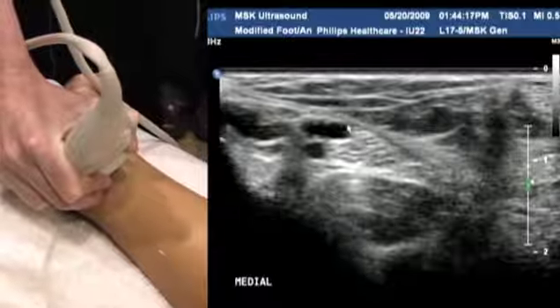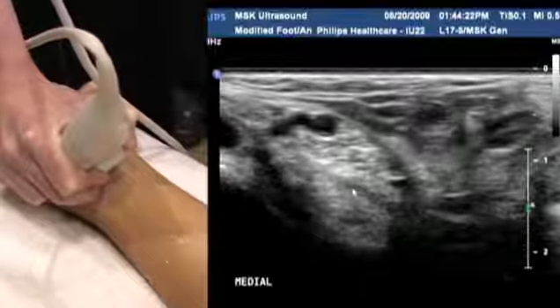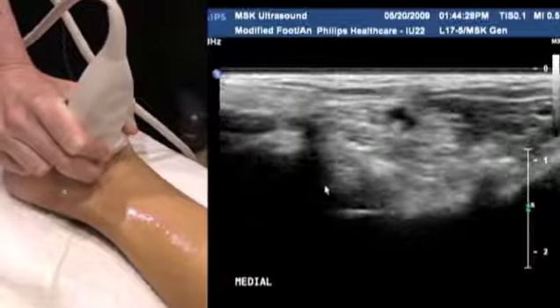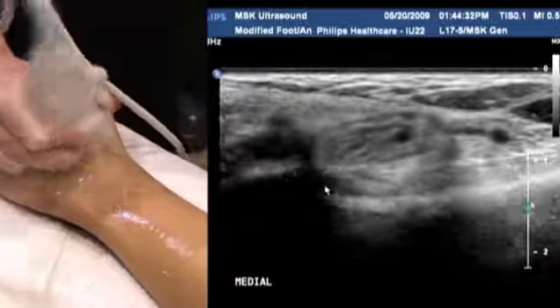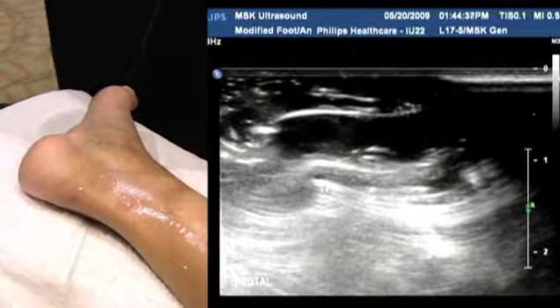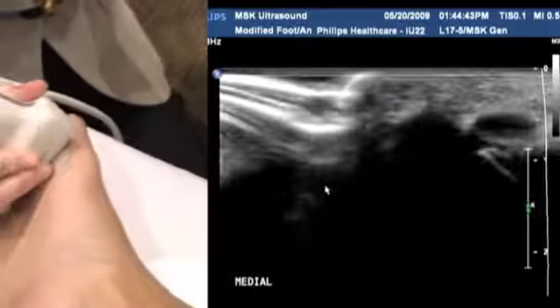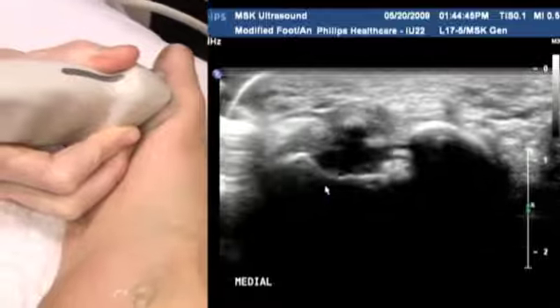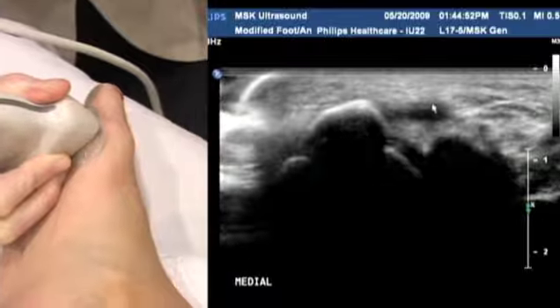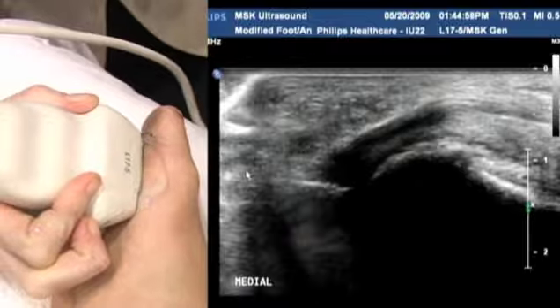We're going to follow flexor hallucis again, heel toeing all the way down through its muscle to the groove here. There it is here, all the way underneath the foot. There's flexor hallucis longus, which, as the name suggests, flexes the big toe. So you need to come all the way down now to the big toe. You can see flexor hallucis here, above the sesamoid, all the way down, and attaching onto the big toe distally.